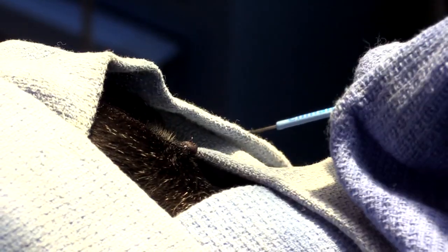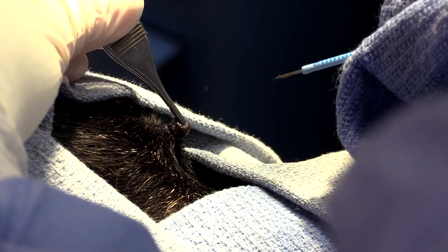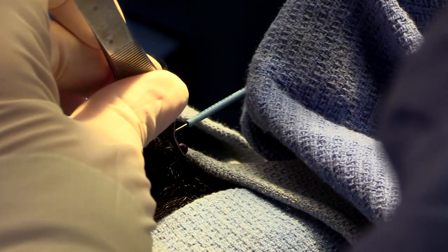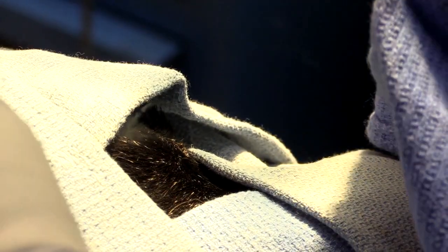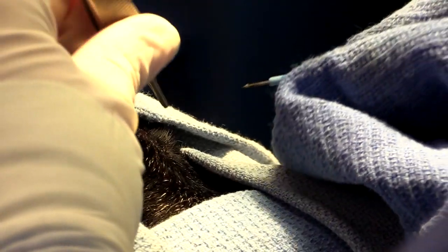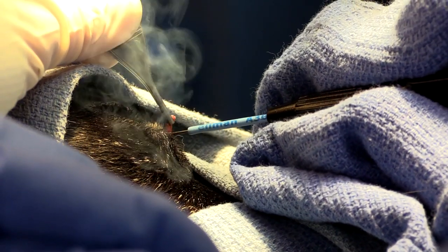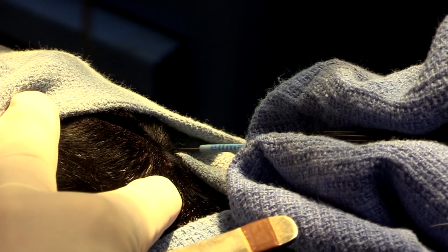Go ahead and take it to a plus ten. These are nice because they cauterize, but I'm just going to go in and clean up some edges. I really like these because you have just such a pretty edge, nice coagulation, nice cauterize, so it leaves an area that is not just bleeding. And on these cases where they have a lot of hemorrhage, this really helps.